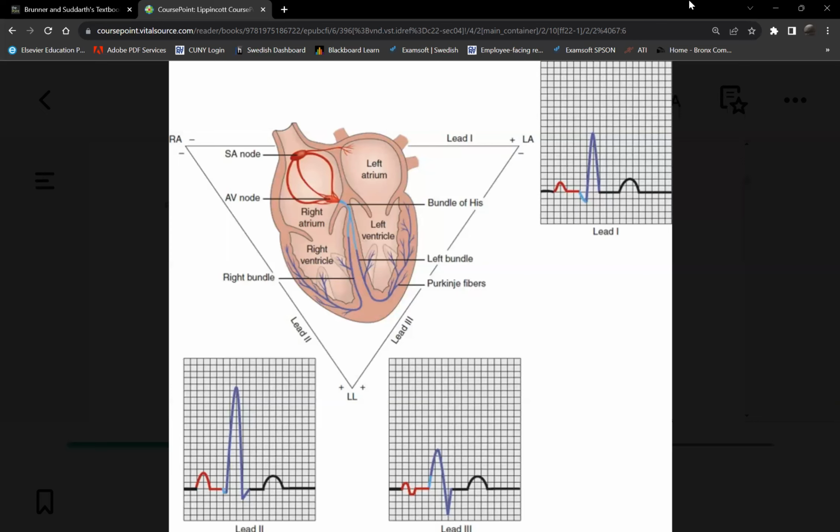So you want to facilitate the ECG reading. That way, when they come in, they see the changes, and we can proceed with interventions right away, rather than you just waiting there, saying wait, doctor's coming, and then the doctor comes, okay, where's the ECG? How come you haven't done one yet? Oh, didn't get an order. That will delay treatment. So you want to put it on ahead.